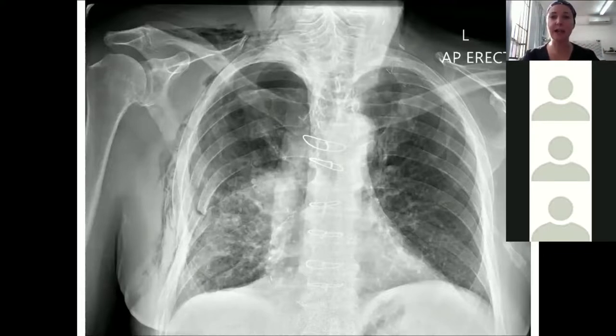Interestingly, this patient's had previous surgery. You can see these wires over here. This looks like previous sternotomy scars. This patient's probably previously had cardiac bypass. I know that there's some oxygen tubing. Here we go. You can see the oxygen tubing running down here. A little bit of oxygen tubing as well. I can't see any ECG leads, and I'm surprised because this patient must be on monitors. If they've got a rib fracture and they've got surgical emphysema, I really hope someone puts this patient onto monitors nice and quickly.